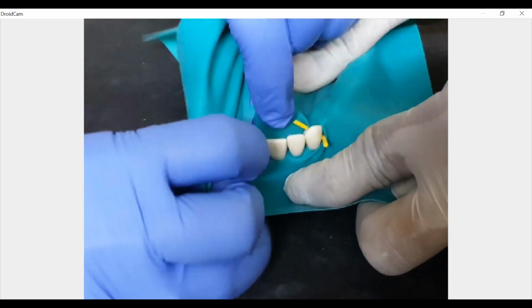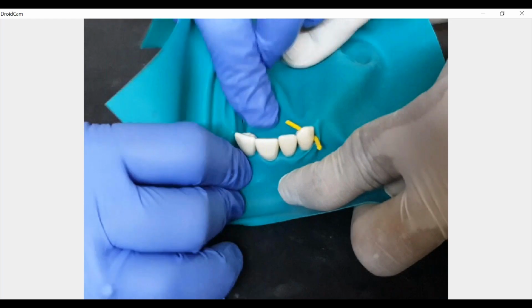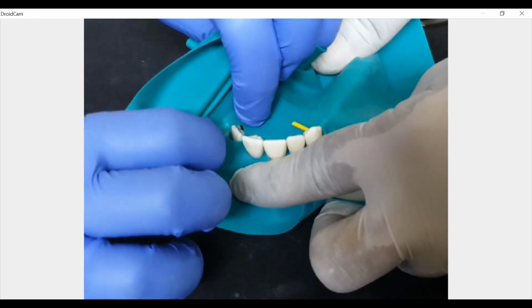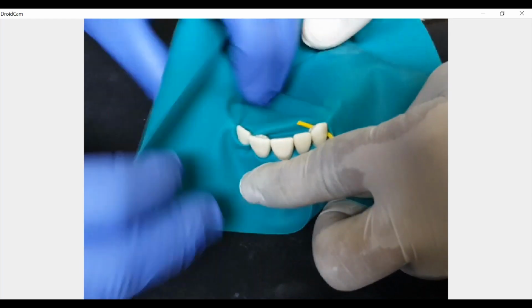Again, we will try the knife edge. So you stretch it, treat it like a knife edge and slice it into the gap like you're trying to cut an apple. Again. Okay, we have fallen short by one.